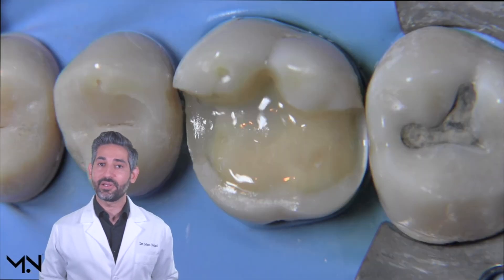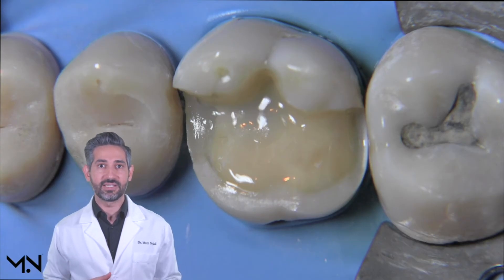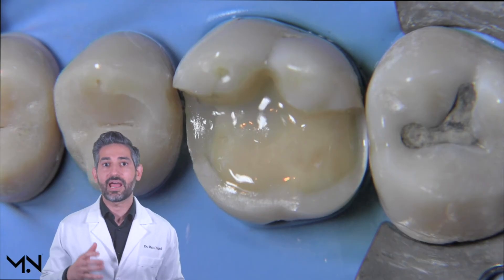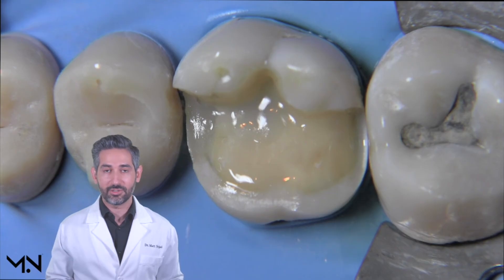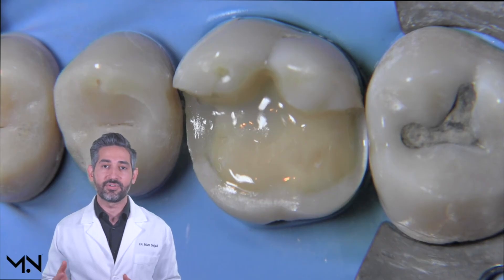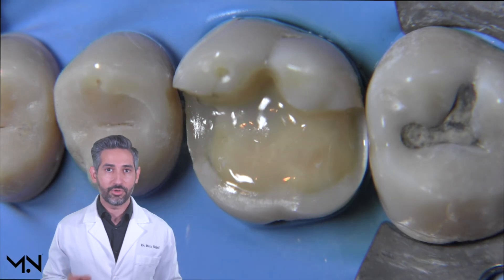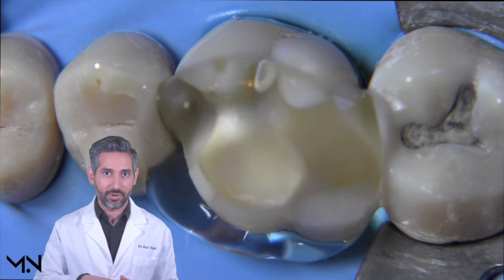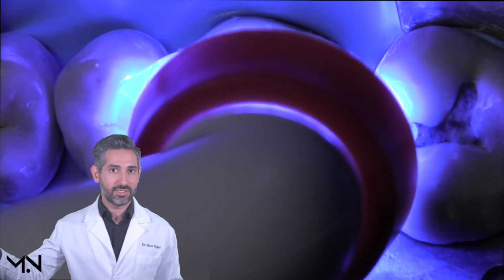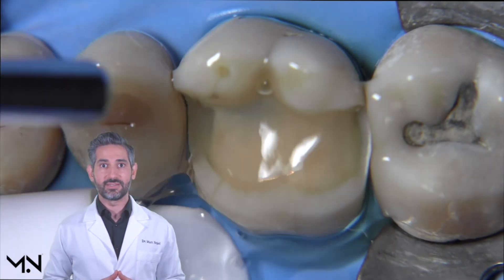At this point there's one important step left called air blocking. During air blocking, you're trying to remove the sticky air-inhibited surface of the resin. If you don't remove this air-inhibited portion, impression materials will often not polymerize fully, leaving a swirl pattern behind, and your temporary will have a high chance of bonding on permanently. All you have to do is apply glycerin over the entire preparation and cure for an additional 20 seconds, which displaces oxygen and polymerizes that air-inhibited layer. Now you're finished with immediate dentin sealing.